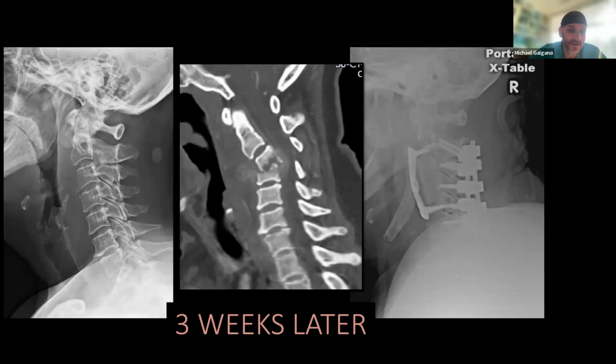The other interesting point you made was about the prevertebral swelling that you see in the X-ray. It's very obvious there, but I'll be honest, Wendy, it's not something I typically look at. We get upright X-rays in all our pre-op patients, but I wouldn't pick up on that just by looking at a plain X-ray. So that's a very keen point. We think of X-rays as just for alignment, but there's obviously more you can appreciate on this film. That's why I like to start with that one, because radiologists too don't always look at that so carefully, and it is important, as you can see from this case.